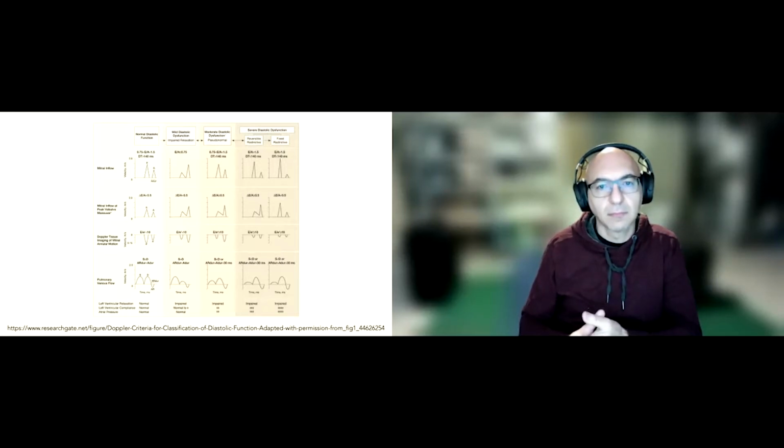And so in this patient, we had a really, really high E relative to A, right? That ratio of E to A was like 3 or 4 or something to that effect. It was 180 over 50. And so that's going to put us way far at the far end of the range of severe diastolic dysfunction. And then you could do the E to E prime ratio as well. And ours was, what do we say, Z? It was 20, which is certainly over that 10 that'd be needed to diagnose severe diastolic dysfunction.